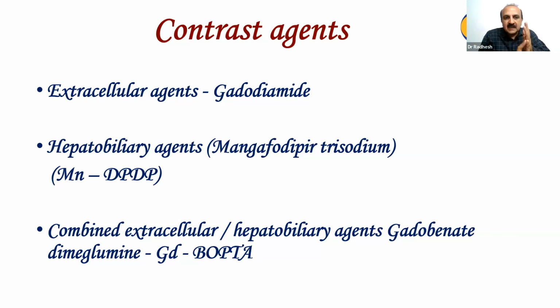You do, say, an arterial phase, an early venous phase, a late venous phase and a delayed phase to look at the enhancement of the tumor or an infective focus. It could be in the liver, spleen, pancreas, or even the lymph nodes. Now, for the liver, we use two substances. One is hepatobiliary, the manganese contrast, which is not available in India. So we do a compromise study.